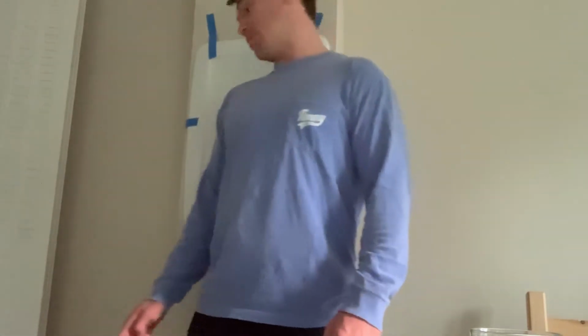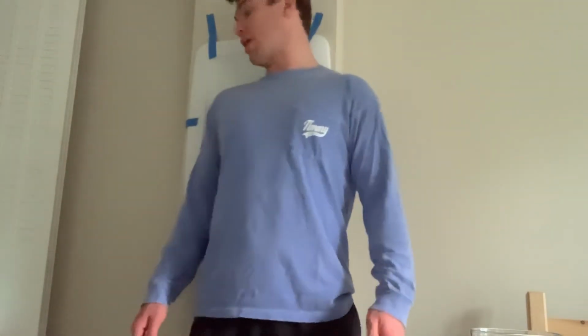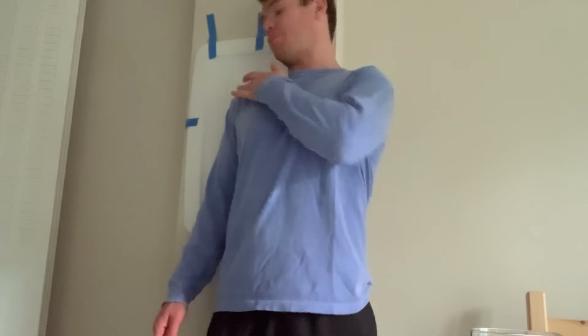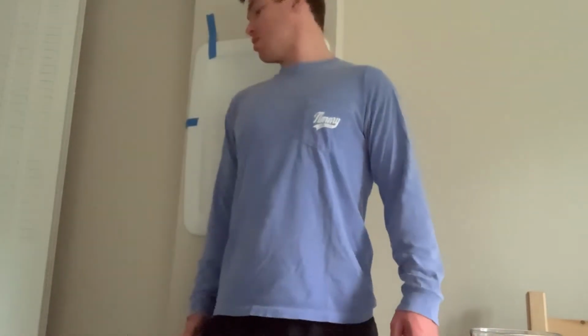And then lastly, we have our A to P AC joint views. So these are going to be the same setup for both. The first one will be not weighted, the second one will be weighted. So the patient's back will again be up against the cassette. Our central ray will be directed through the AC joint, like so. And then we will do the same setup again with a 10 to 20-pound weight in the patient's hand.